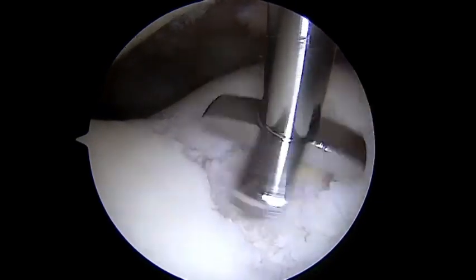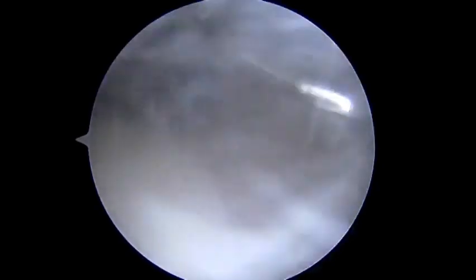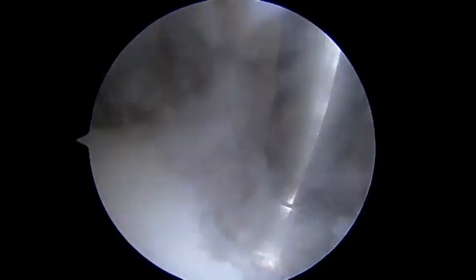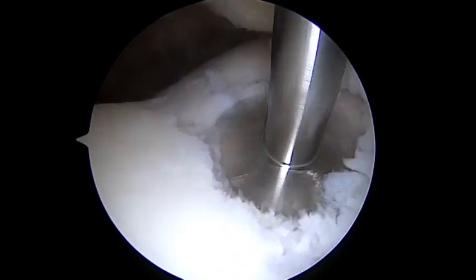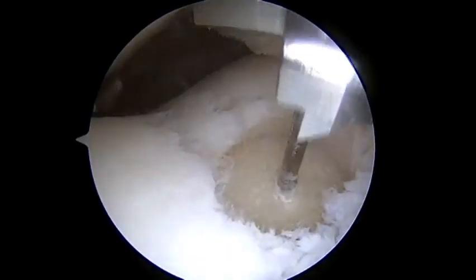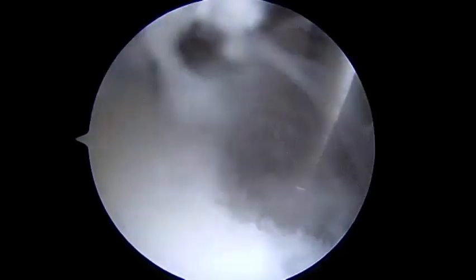There's contours of the top of the blades also to mimic the top surface of the implant, which is to be fully countersunk below the top layer of subchondral bone. The flutes are designed to cut and remove debris so as not to impact the bone to create a nice bleeding bed. The superficial layer of diseased bone, hypertrophic bone, is removed down to more healthy bleeding bone.